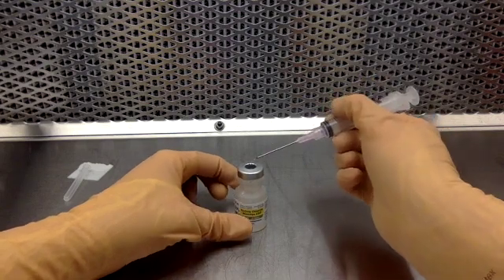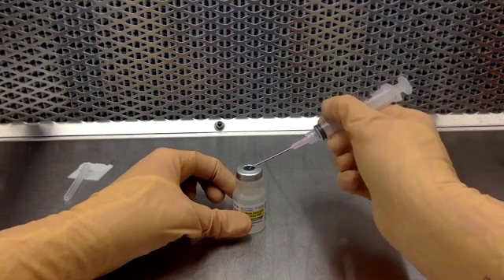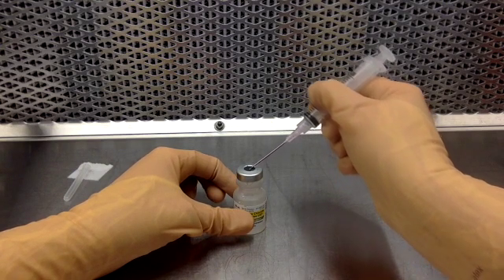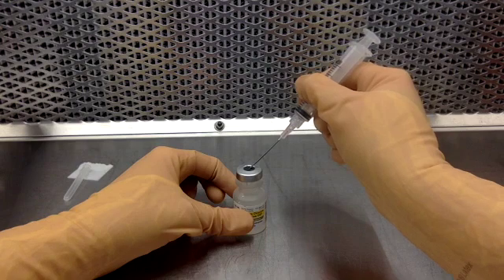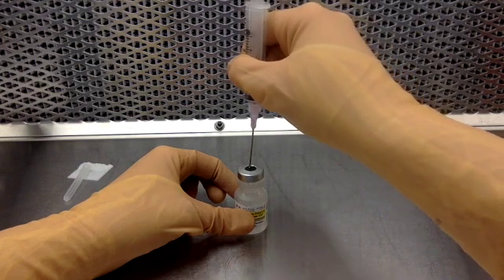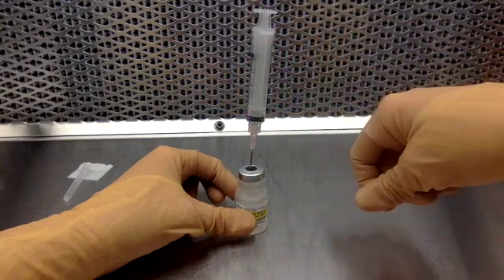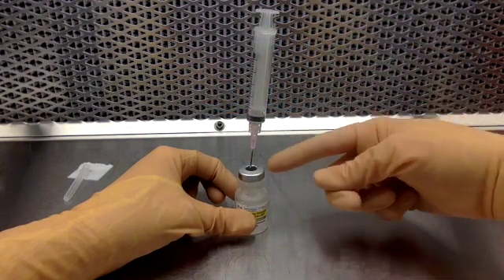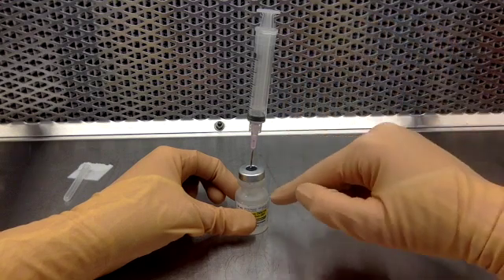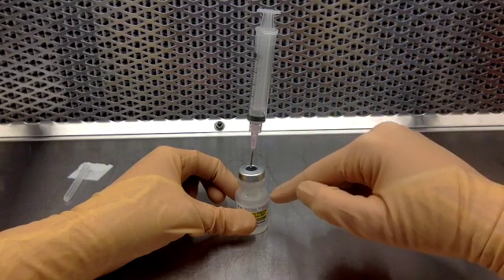You're going to gently go in through the center, depress the tip of your needle into the rubber septum, and as you ever so slightly enter into that, once the heel meets that rubber, you're going to move from a 45 to a 90 degree angle to finish your penetration. You always want to see silver, okay? You never want the hub of your needle to come into contact with your rubber septum.